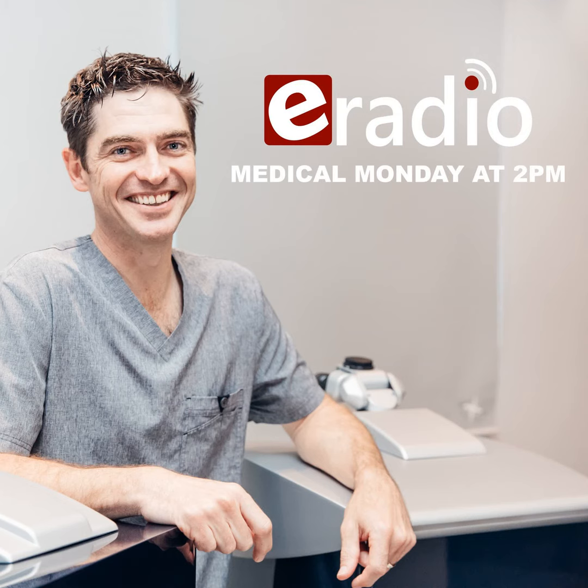Dr. Joseph, laser vision correction is commonly used to get rid of spectacles, right? But are there other applications for the laser as well? Yeah. So spectacles, obviously contact lenses is another mention. Reading glasses, once you're above 40, 45, those are what we call the refractive applications of laser technology.